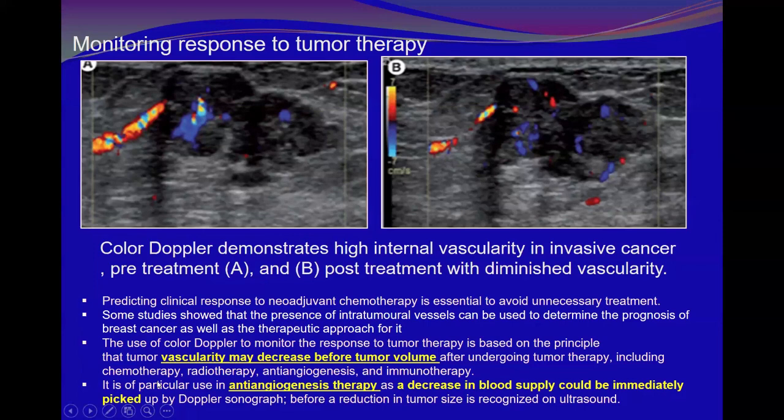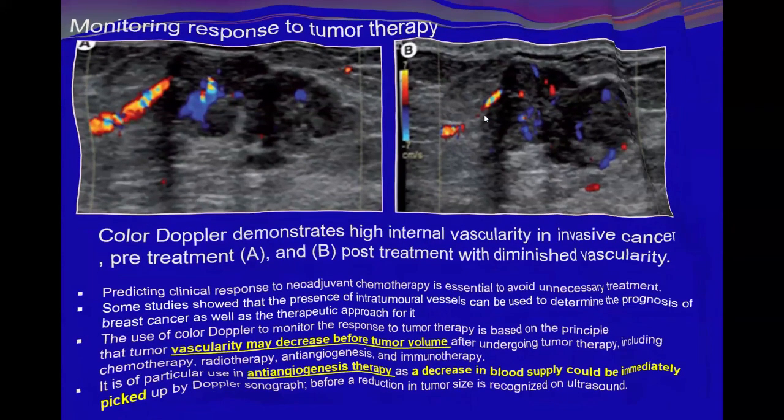So because they attack, especially with antiangiogenesis therapy, okay? The antiangiogenesis therapy will regress the process of angiogenesis, and the vascularity of malignant lesions, as we mentioned, is attributed to this process, and definitely is going to regress on follow-up, as we have seen in this example. Look at the feeding vessels, how they are getting smaller in the post-treatment image.